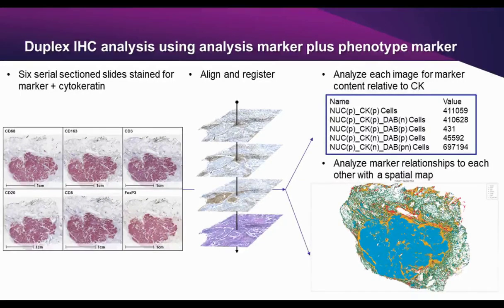The top one, which has pan-CK on each side, we were able to get each analytical marker's relationship with cytokeratin, including within, outside, and proximal to. On the bottom one, we also generated a spatial map for all the analytical markers to observe relationships between the cell subpopulations. The primary advantage over singleplex IHC was to confidently analyze for our key metric, the marker relationships to cytokeratin, with less concern in changes to tissue morphology or drop sections.